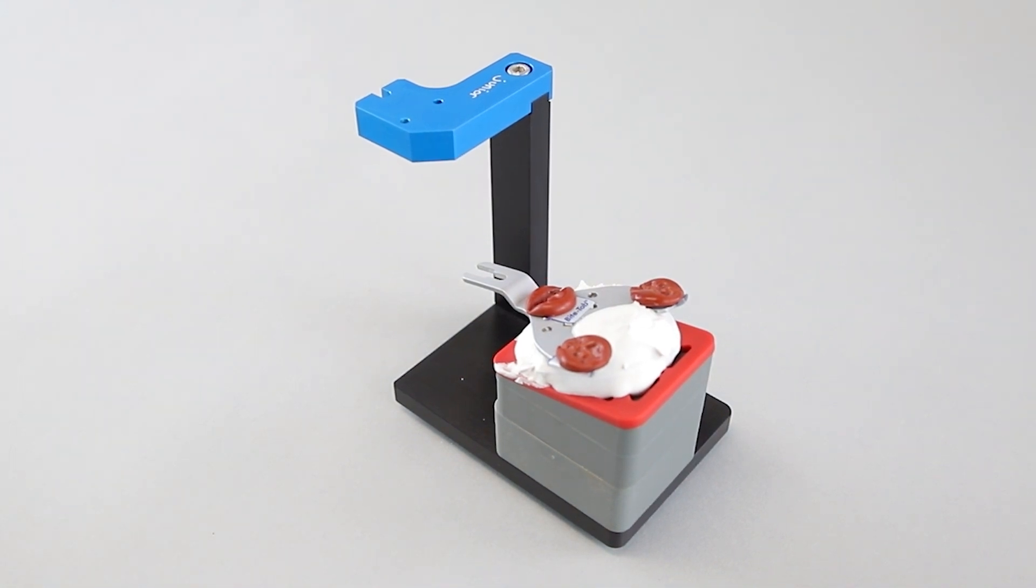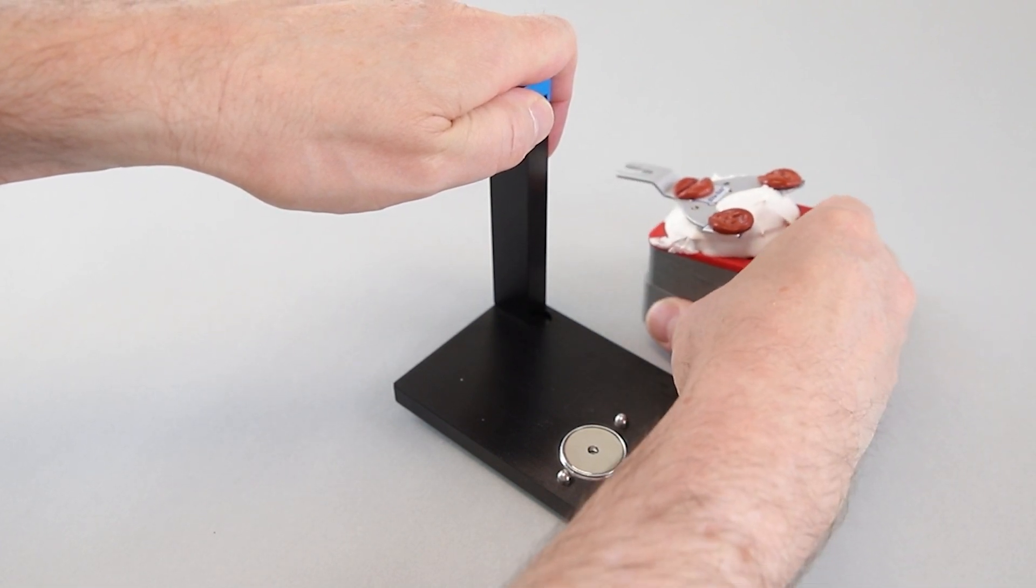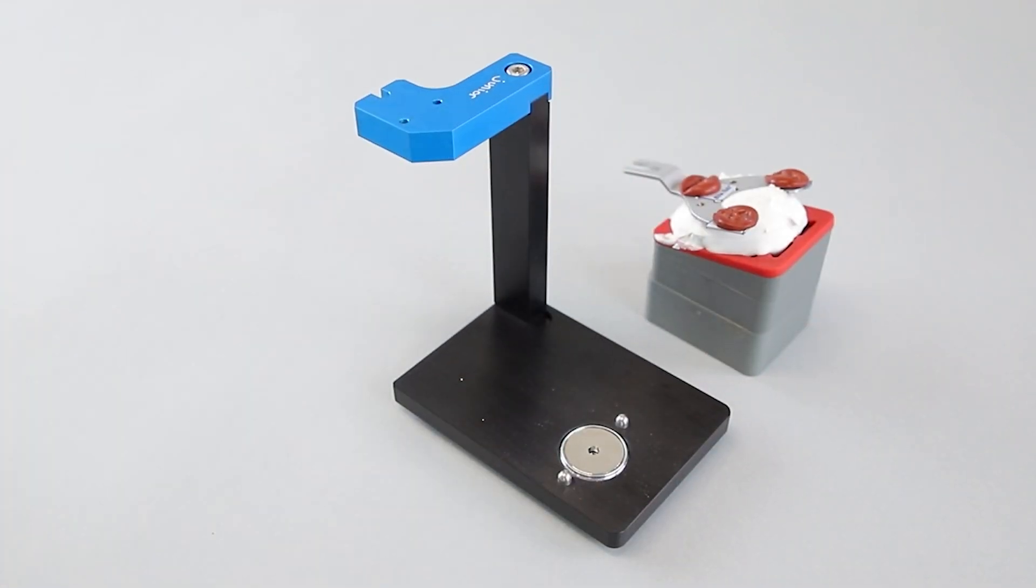Take out the bite fork with the transfer table from the Transfer Stand AB Jr. Now you can fix the bite fork into the Reference SL Articulator to articulate the upper cast.